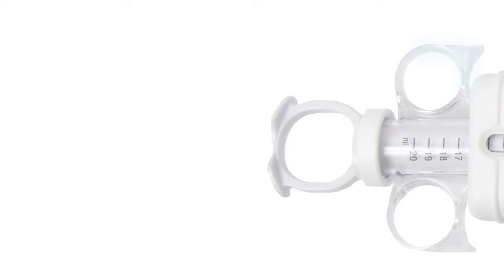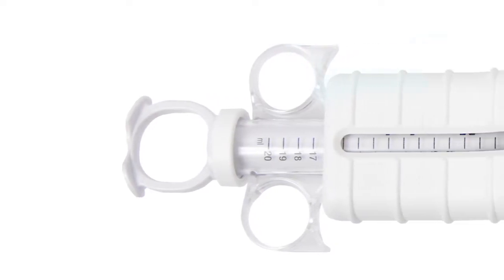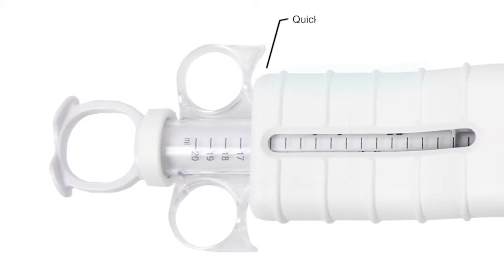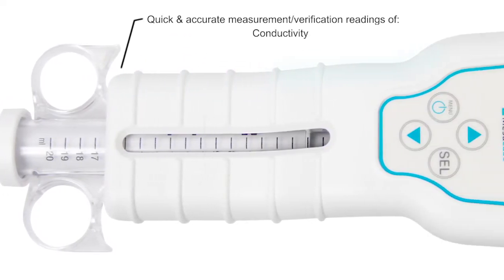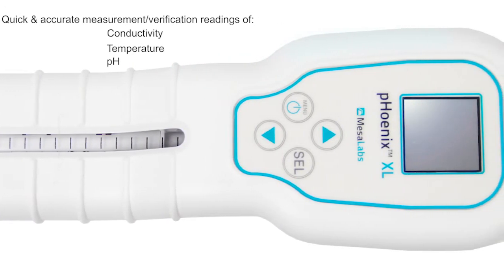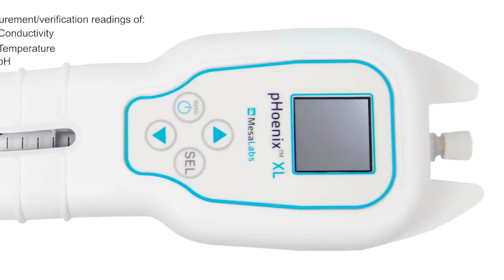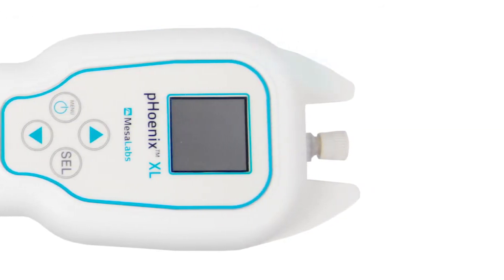As Mesa's most advanced syringe style meter to date, the Phoenix XL is a convenient hand-held meter for quick and accurate measurement and verification readings of conductivity, temperature, and pH. The Phoenix XL meter is easy to use and stores easily when not in use, while the syringe style design saves you time by allowing you to gather a sample directly from the sample port on the dialysis machine.